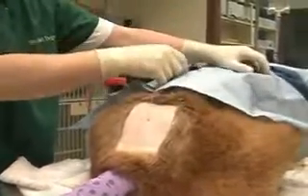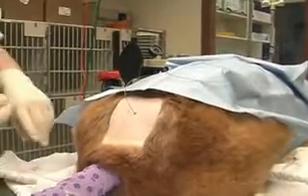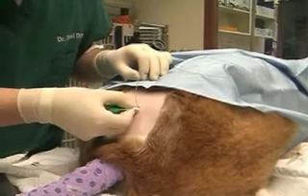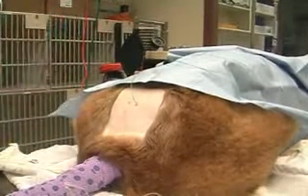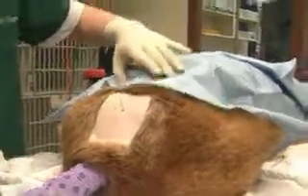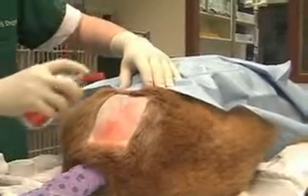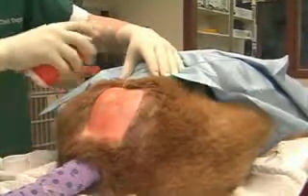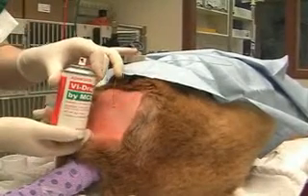We're now going to put a little bit of triple antibiotic ointment at the level of the port. You don't want to put very much of it because it will prevent the patch from sticking. Now we're going to spray the area and a little bit of the hair with some adhesive called Vi-Drape.